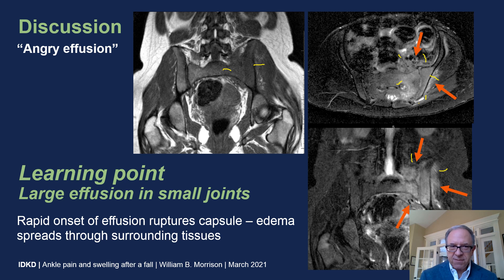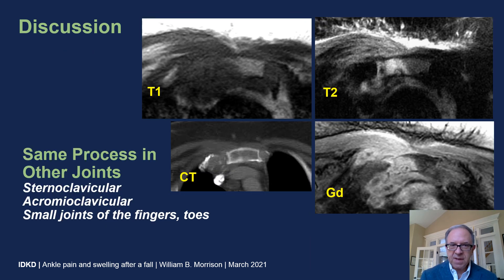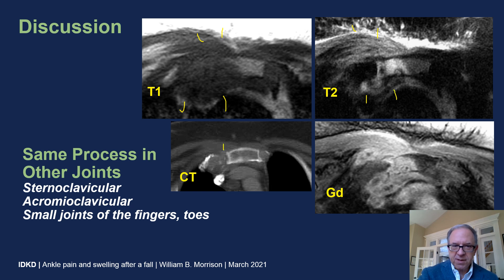This pattern is not specific for infection but should prompt you to look for other signs of infection. The same process occurs in other joints around the body, especially the smaller joints. At the sternoclavicular joint, we again see this diffuse soft tissue edema extending from the joint into the adjacent soft tissues, with erosions visible on CT.